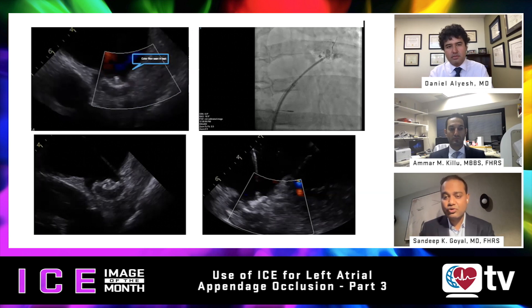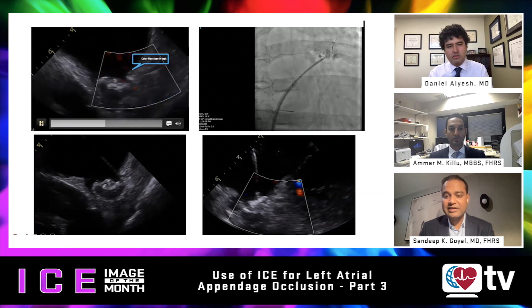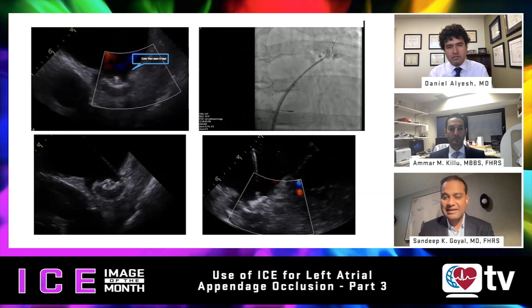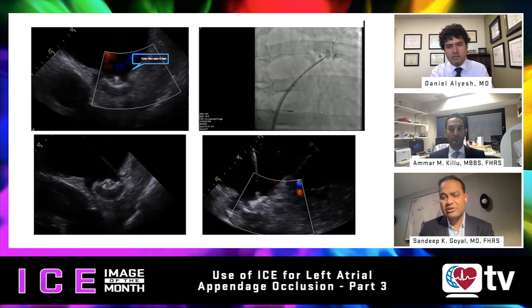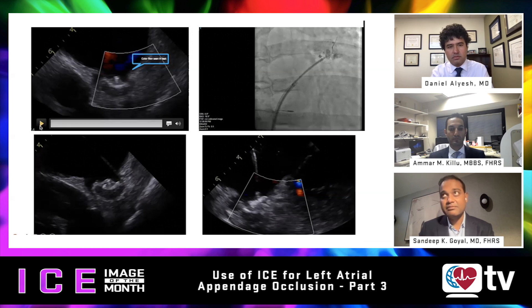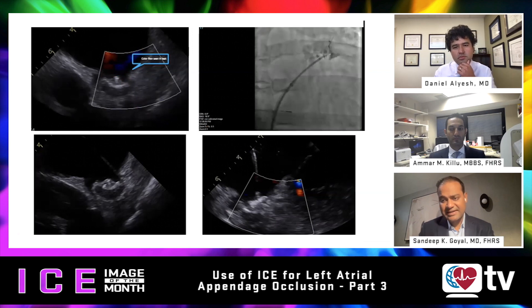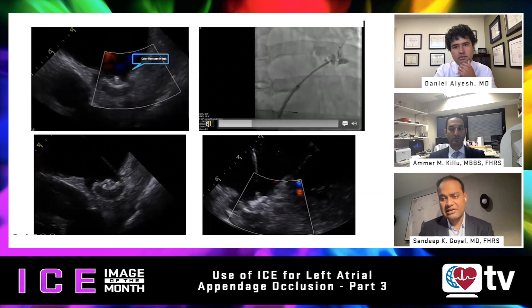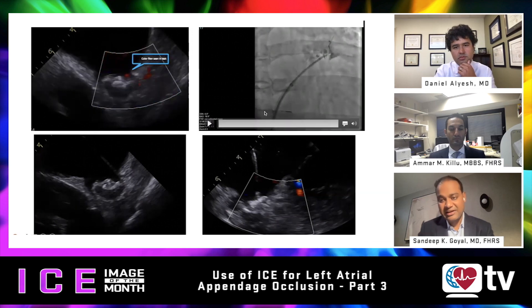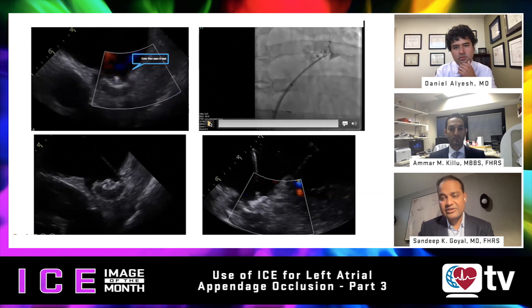The first image shows an ICE image capturing the leak. There's a prompt marking the area where you can see the leak, with the ICE catheter in the left atrium looking at the left atrial appendage. This view is a hybrid of the transmitral view with a tight right steer, so you can see that corner quite well. On the fluoroscopic panel, there's a wire inside the leak with a multi-purpose catheter injecting contrast, confirming the leak seen on ICE.